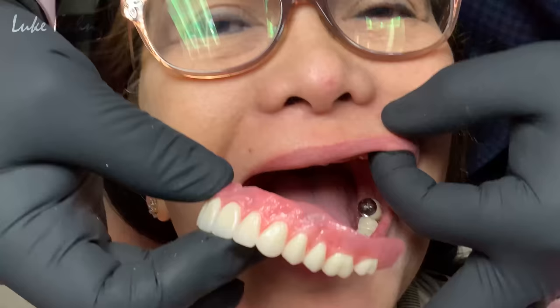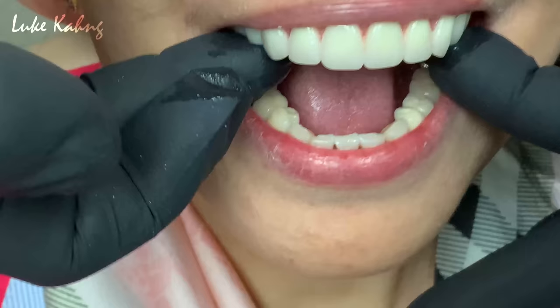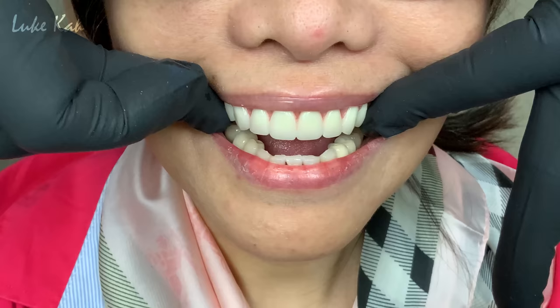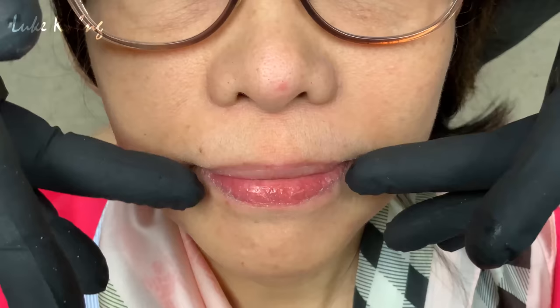So now what we wanna do is we wanna make sure that we have a good bite, good occlusion, so that when they fabricate it, when I send it in for final, it'll actually fit her nicely. I take a look at the incisal edges that they match. I come up from the position on top to make sure that the midline is correct with the facial midline. And I have you bite down gently, close, all the way. And then I allow her upper lip to relax, lower lip to relax. She can close just fine. And then smile. There we go, beautiful.